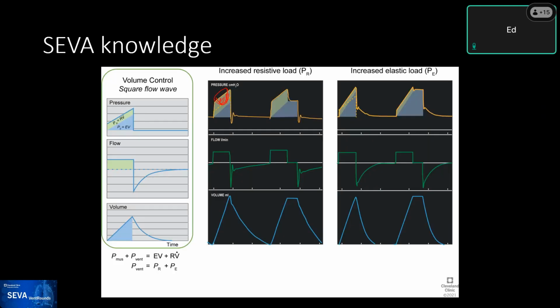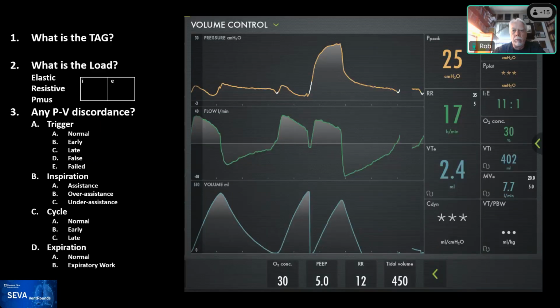Rob, any comments here? Nope. All right. So let's start with this one, and I'm monitoring the chat on the lateral image because I'm presenting this from all the way over here.